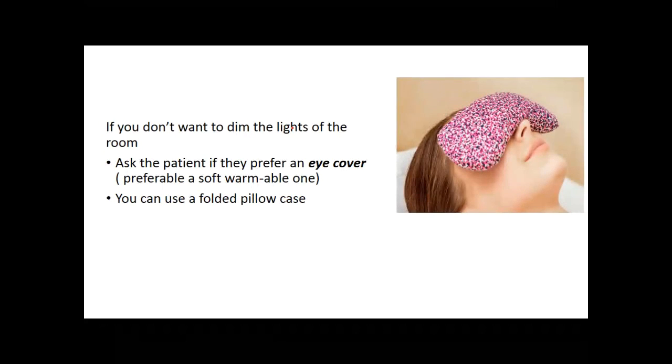If you still don't want or can't dim the lights, ask the patient if they prefer an eye cover. There is science also behind it. When you cover the eye, the patient will relax and their anxiety will be reduced. If you don't have an eye cover, you can use a pillowcase, just fold it and put it on the patient. Make sure that you are not closing their nostrils.